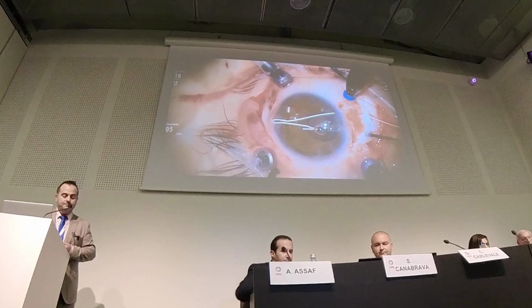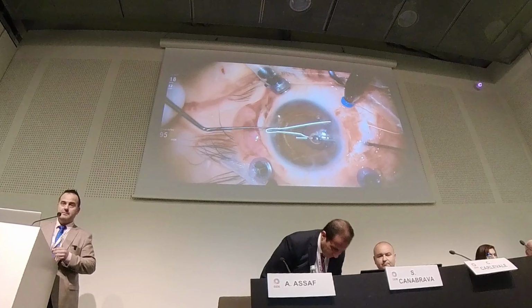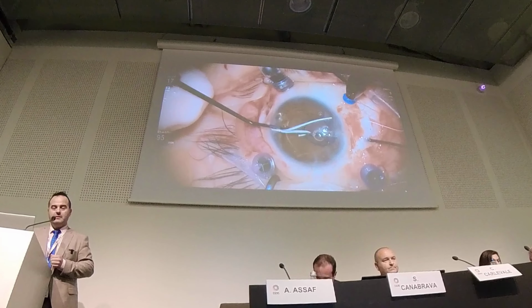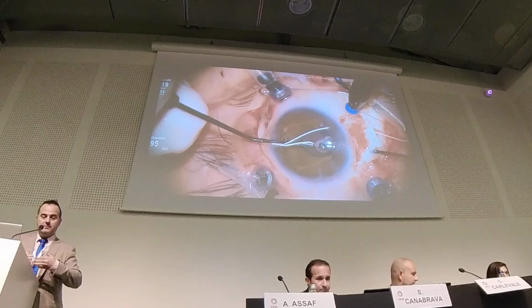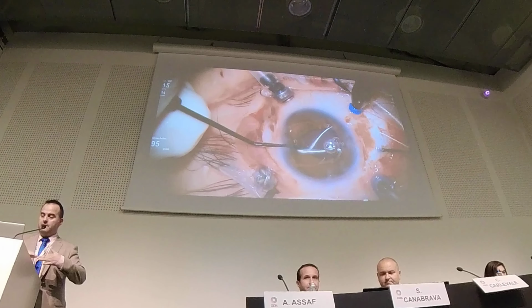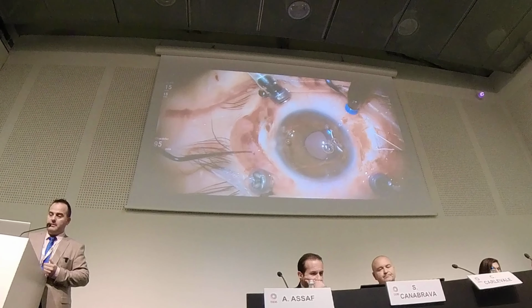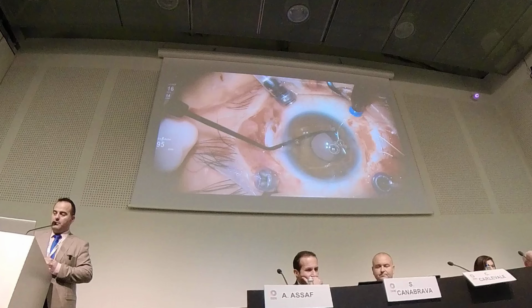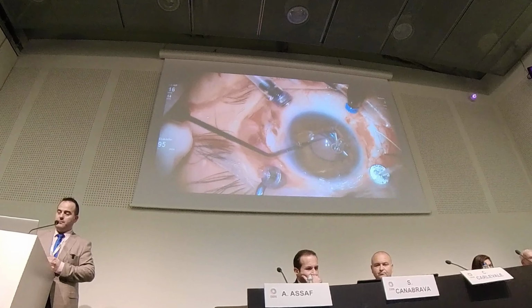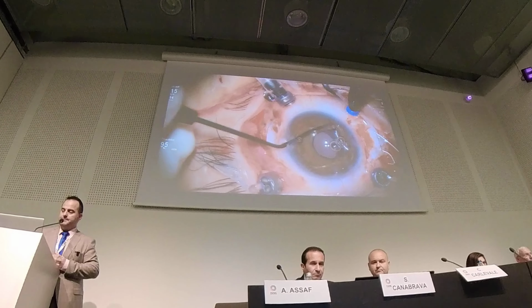If you are using, for example, vitreoretinal forceps, they are straight, and from the temporal side it's sometimes easy, but from the nasal side it might be difficult because there is no curvature of the instrument. So here the trick is to carefully pass the Gore-Tex suture through the eyelets of both haptics, and then carefully pass the lens behind the iris.